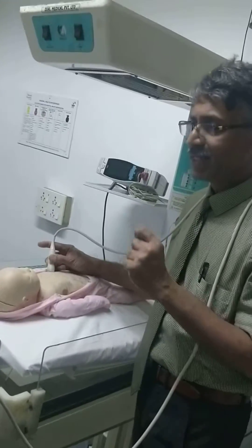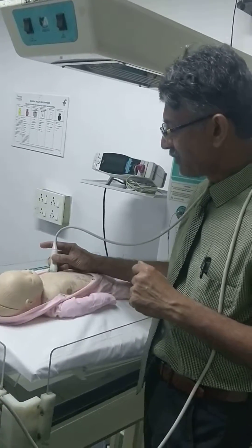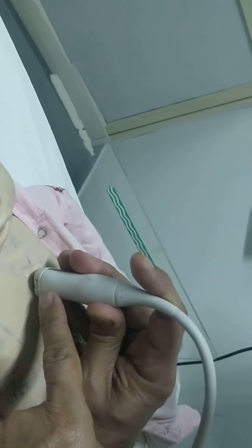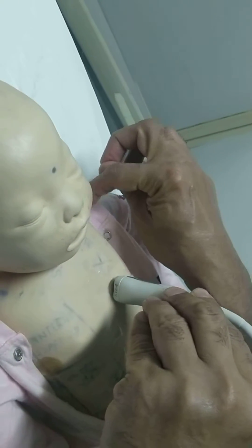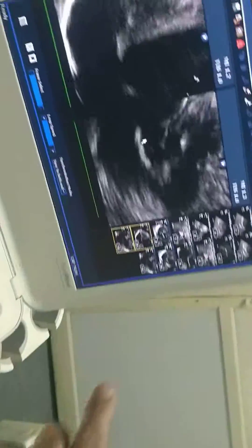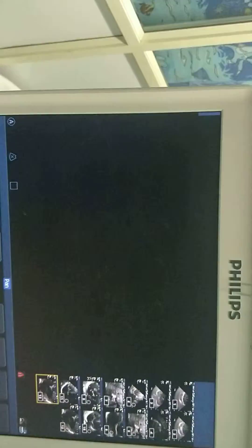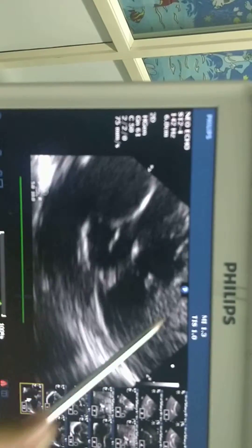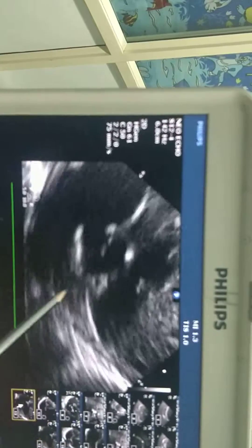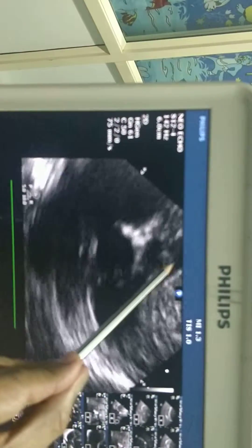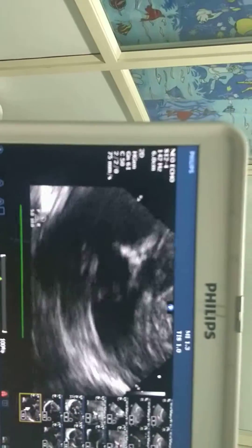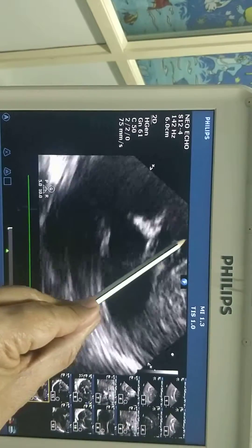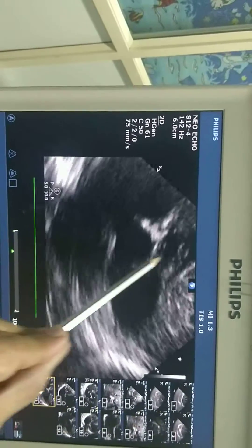The ventricular connection is also demonstrated using bedside echocardiography. For that, the probe is kept in the left second intercostal space with the marker facing to the left shoulder joint to define the structure. This is the right ventricle — this is what is called the great artery relationship, which is seen normally. Normally, the pulmonary artery is situated anterior to the aorta. The aorta acts like a cup and the pulmonary artery acts like a saucer — this is also called the cup and saucer relationship.